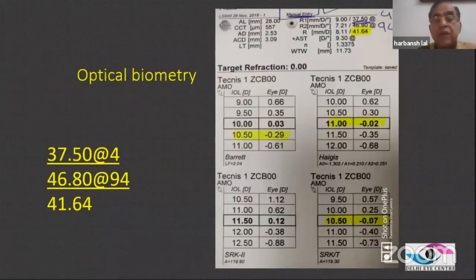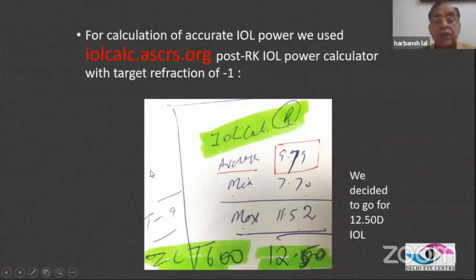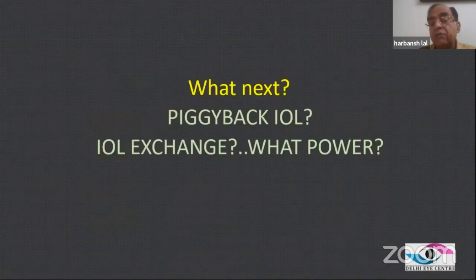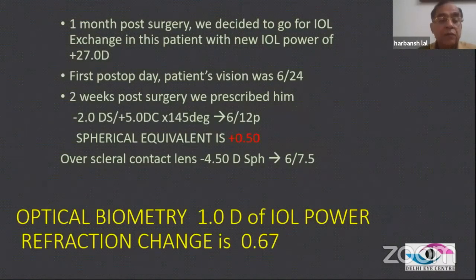This is another case planned for cataract surgery. You can see the keratometric value is 46.80, which is very unlikely. And the power which we were getting was 10.5. That means somewhere there's ectasia coming into place. We did the IOL calc and, though the maximum was coming 11.52 with minus one targeted refraction, we still went for 12.5 and we landed up with gross hyperopia, and the final acceptance of the glass was plus nine with 4.5 diopter. So you can see how much, because the area which was 46 was the keratometry of the ectatic area on both the equipments. So then we removed the lens and we went for a 27 diopter IOL exchange.